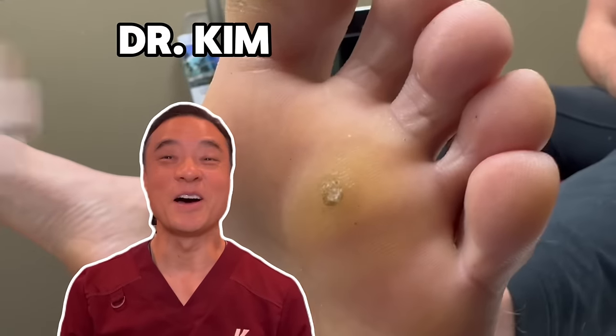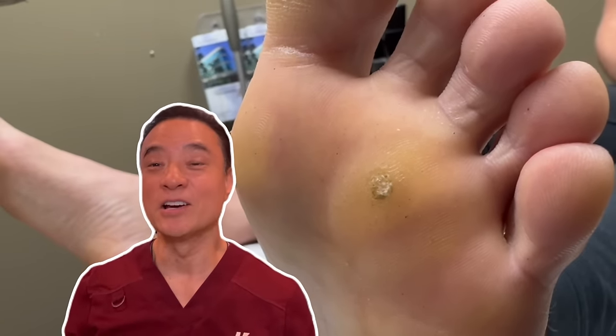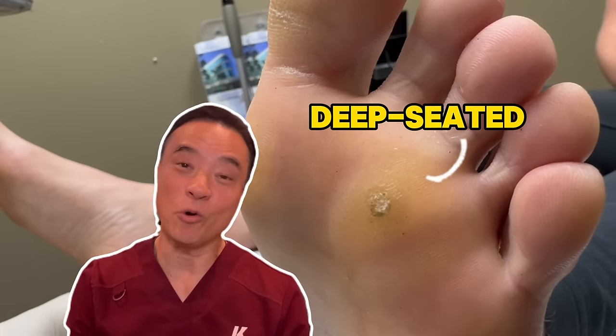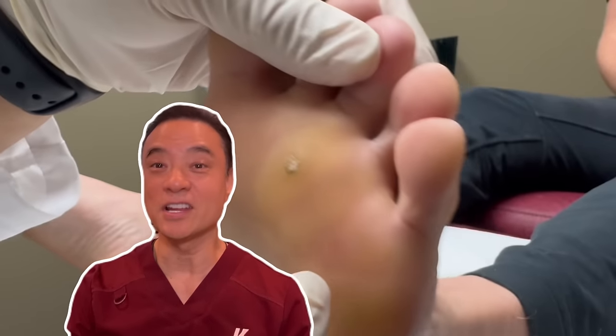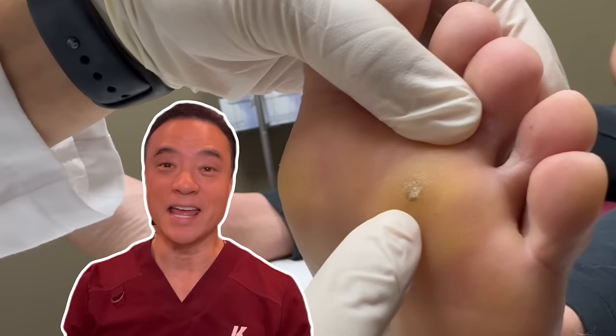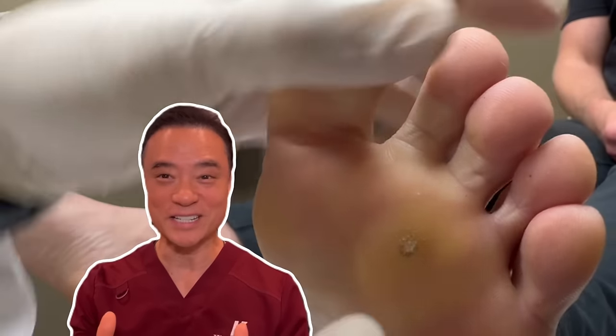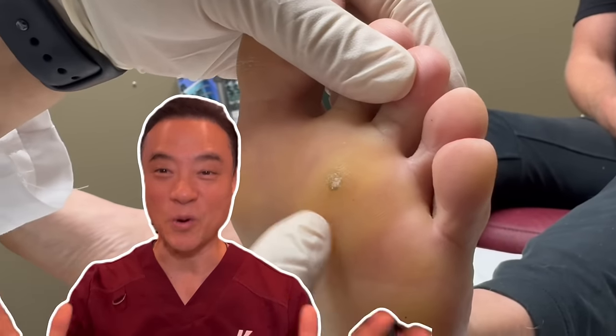Hi, everyone. This is Dr. Kim, America's holistic foot doctor. In this video, you meet my patient who has developed a deep-seated corn from teaching dancers for many hours a week. He recently had this burned, and now he is here to have this removed. Let's see how I can remove this without absolutely no pain at all.